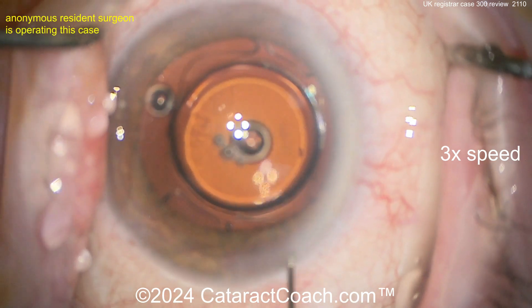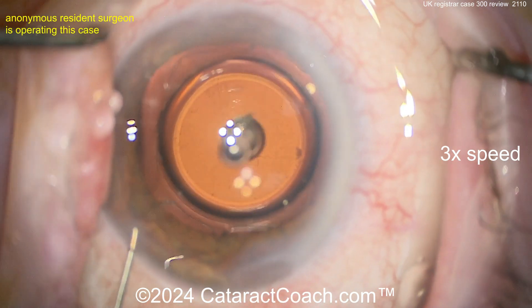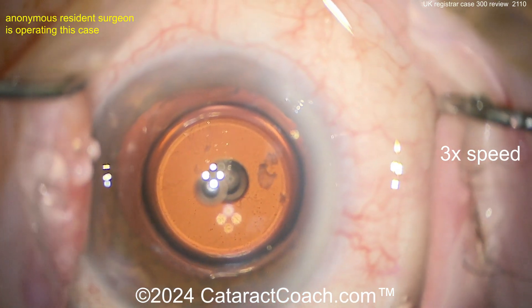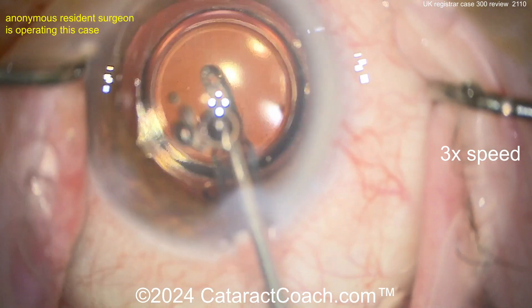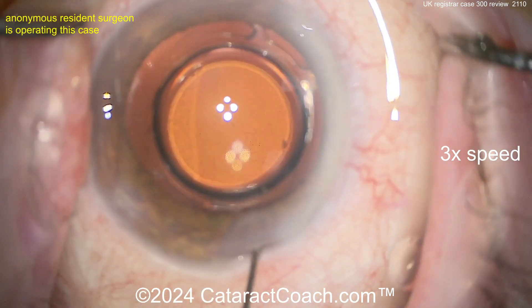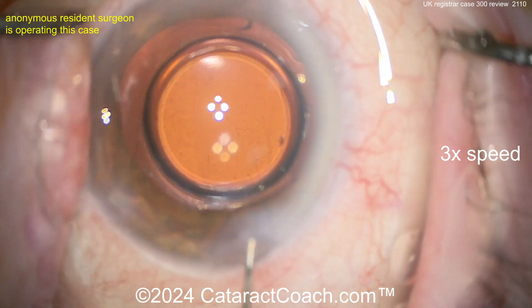Let's see what finishes up the case here — sealing up those incisions, nicely done. I would not leave those little chunks in there; get the I/A probe back in one more time and get all those cleared out. I like to clear up the air bubbles too, although that's not as important. Now let's seal this incision up.